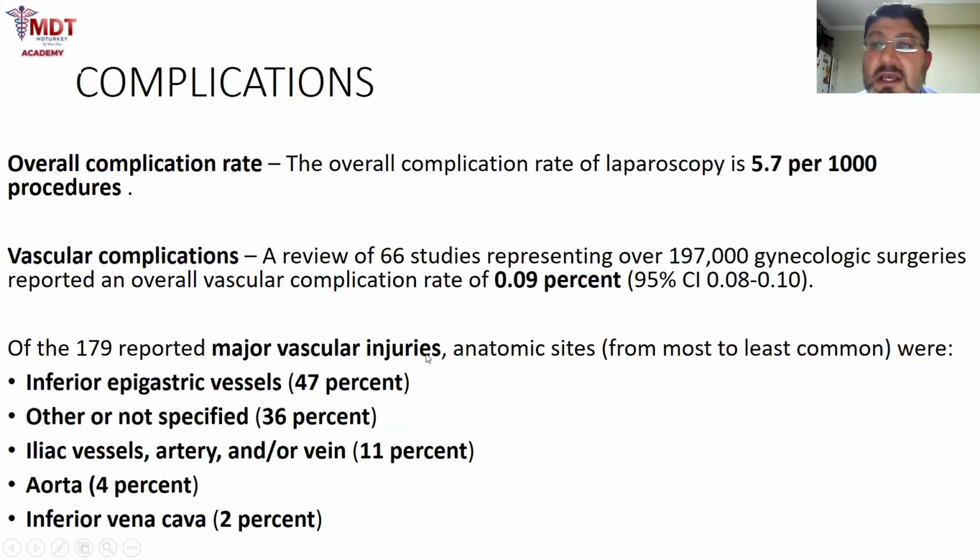These complication rates are reported by the advanced laparoscopists, so they are too low because everybody is doing laparoscopy. If the surgeon is a beginner laparoscopist, his complication rate will be higher, and after the learning curve, when he is a moderate laparoscopist, his complication rate will decrease. If he is an advanced laparoscopist, his complication rate will be much lower, of course.